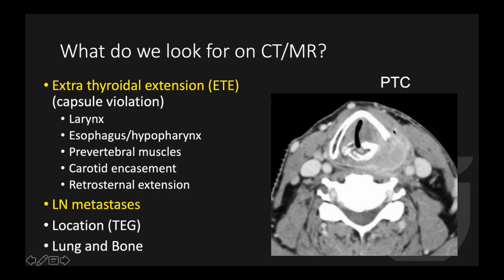Here is a papillary thyroid cancer extending into the larynx through the cricothyroid junction. Notice this cricothyroid junction looks pretty normal, but it is widened by the mass with truncation and destruction of the thyroid lamina. There is sclerosis of the cricoid and arytenoid cartilages, and the tumor also extends into the retrocricoid hypopharynx. These are very important findings because the surgeon needs to perform not only total thyroidectomy but laryngectomy if this patient needs surgery.